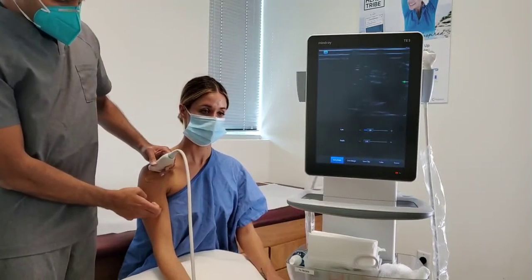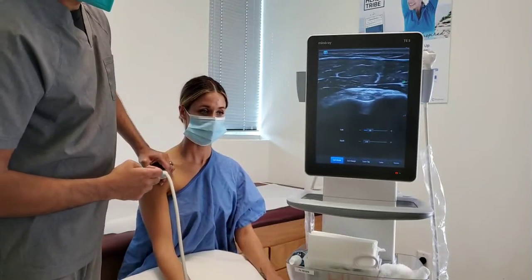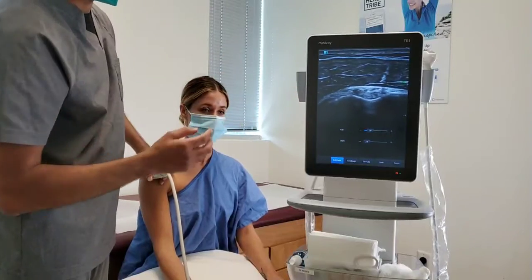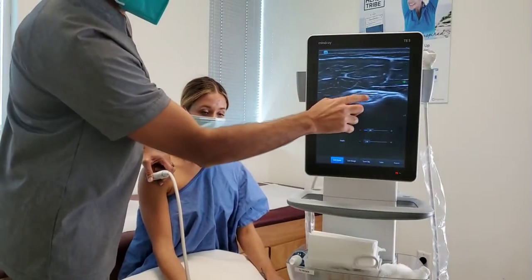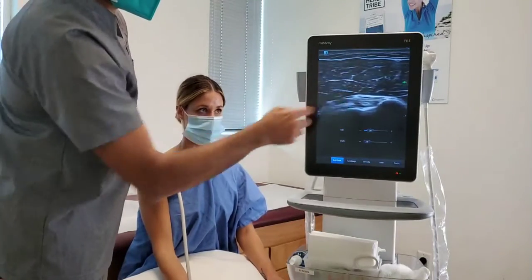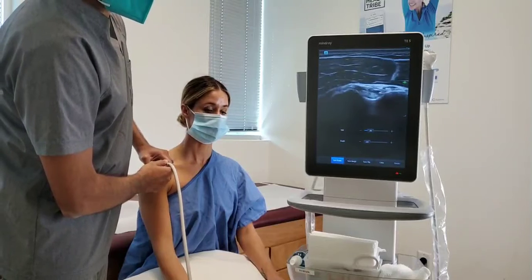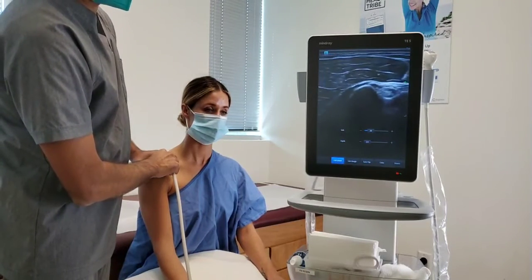The biceps muscle here becomes a tendon that attaches all the way inside the shoulder, and this tendon is now what we're looking at in cross section. So if you can imagine the tendon like a cylinder, we're now cutting that tendon so we can see that as a circle here. Above that tendon is the muscle, and what we do is scan up and down and see if there's any irregularities in that tendon, if there's any tendon tears.